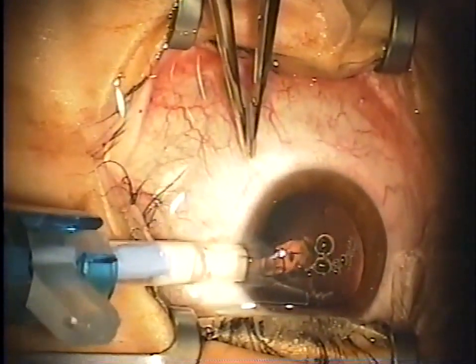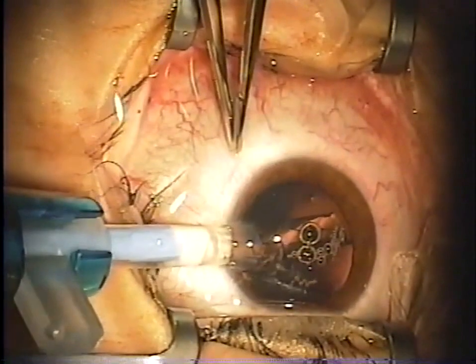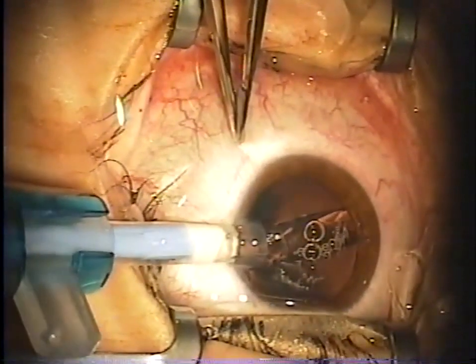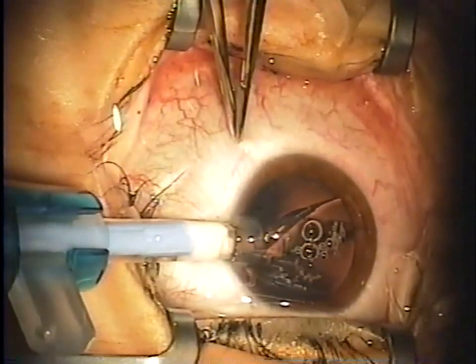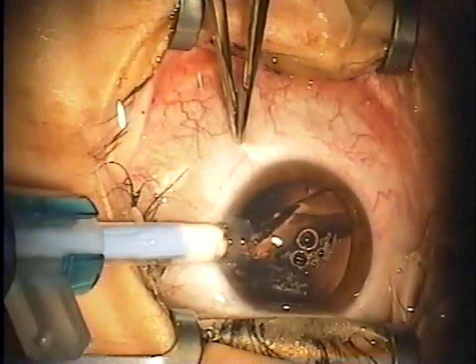This lens does want to stick to itself and not unroll very easily, so you want to use a gentle tapping motion with your thumb on the plunger of the injector as you're tapping the lens out into the anterior chamber. As the heat of the aqueous starts to work on the lens, it does become a little more pliable and will start to unfold.